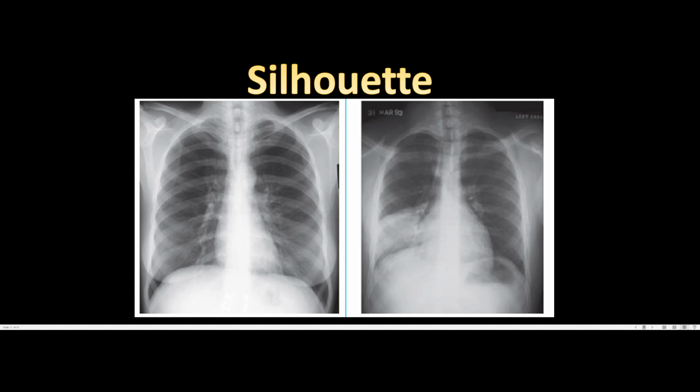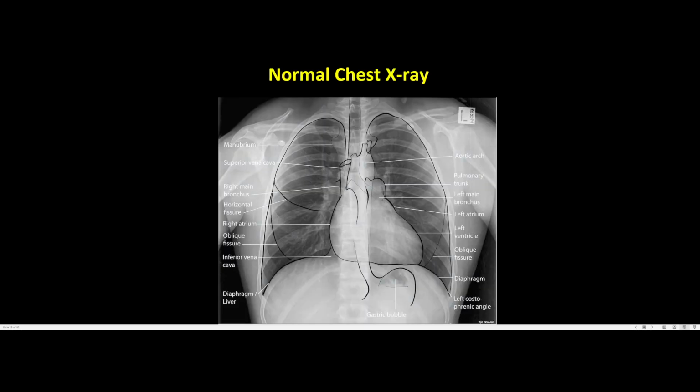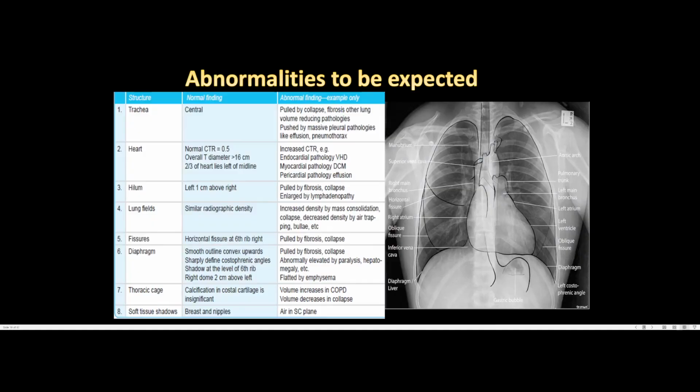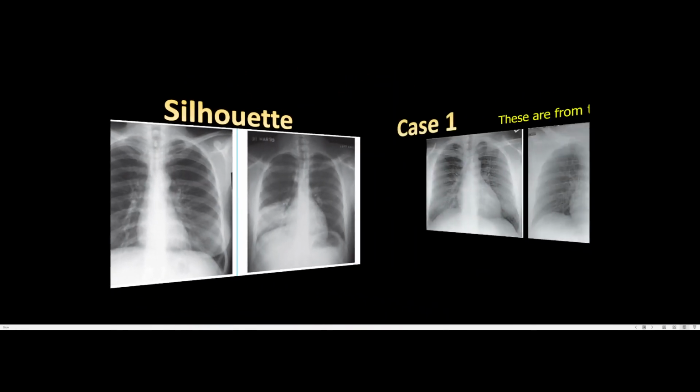So of course, a lot of the slides explain a lot of the basics of chest X-ray. Again, you can look up previous videos that I've uploaded on the YouTube channel to explain it in better detail and really apply some of the information. So we'll just look at some of the cases in this PowerPoint slide.